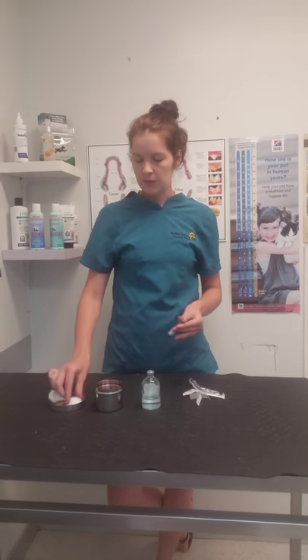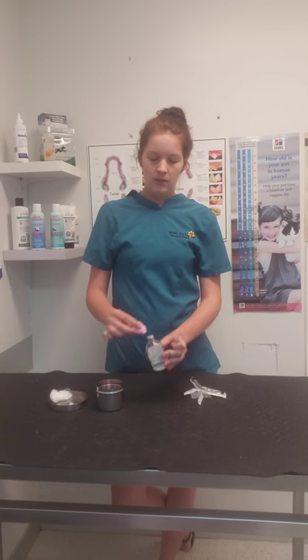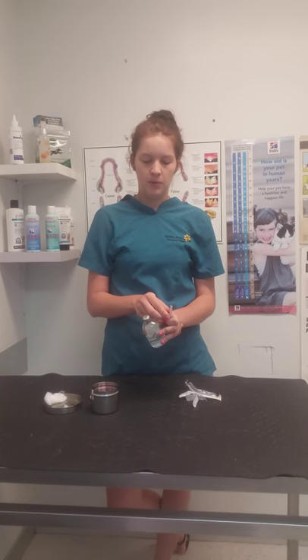We can then take a swab and do an antiseptic solution with the top of the multi-dose bottle.